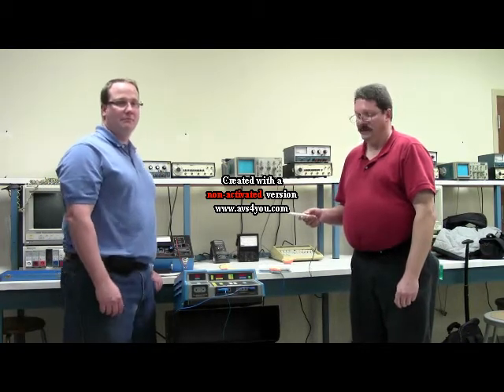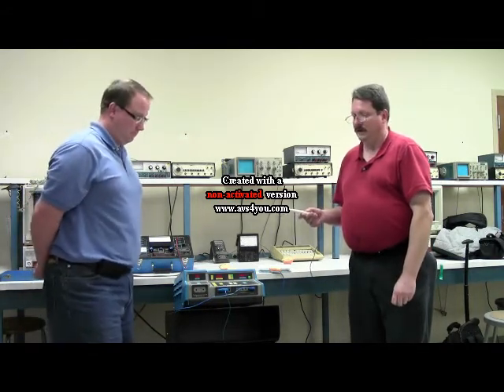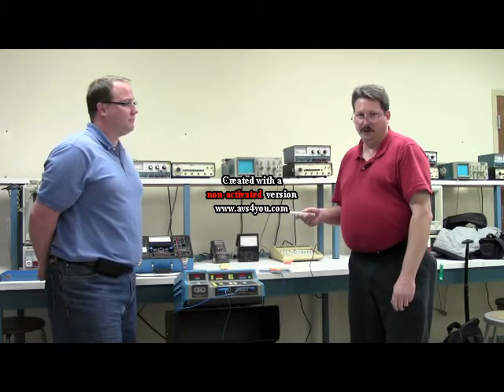We're going to demonstrate the basic PM for a Valley Lab Force 2 Electro-Surgical Generator, more commonly known as an ESU for short.